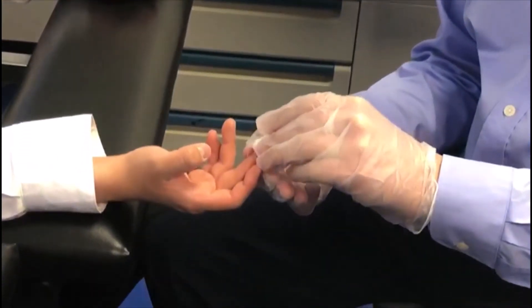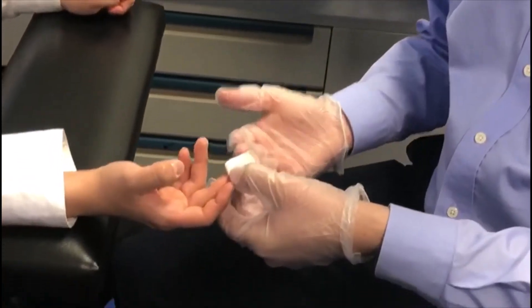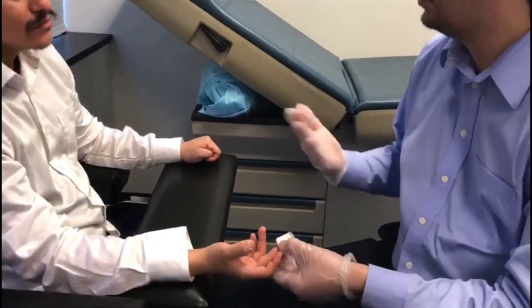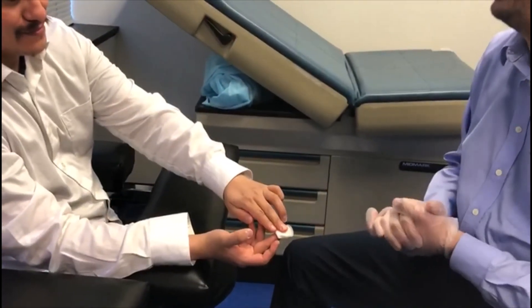From here we're just going to put the gauze pad on and apply pressure for about a minute — maybe even have the patient apply pressure for us. Sir, can you please apply pressure and hold on to that for a minute. Thank you, and that's really everything you need to know about the dermal puncture. Thank you for your time.